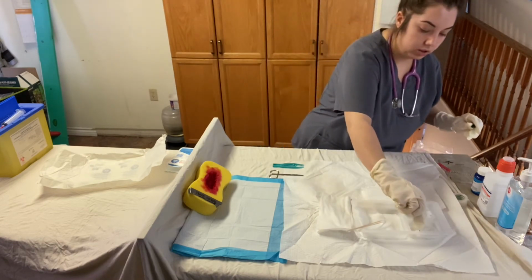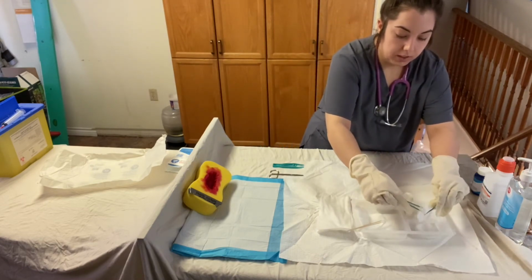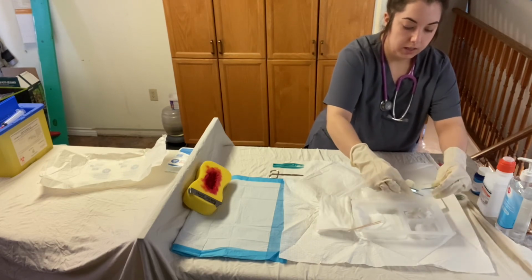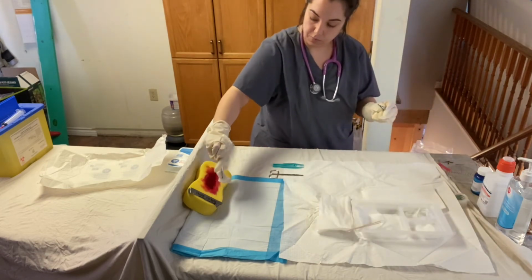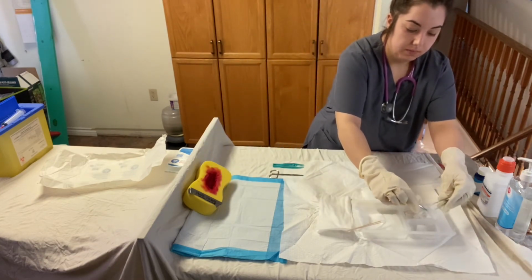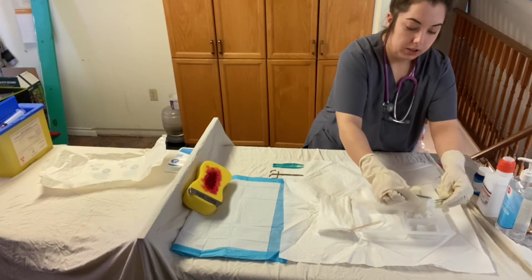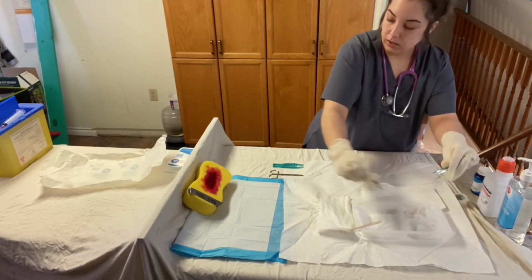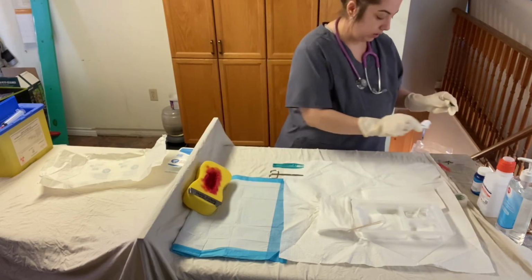One wipe for each. I'm just going to do the same thing here, maintaining the same sort of technique, maintaining the same sterile field. And I'm going to do this a few times. I just want to make sure that this wound is completely clean and good to go. Okay.